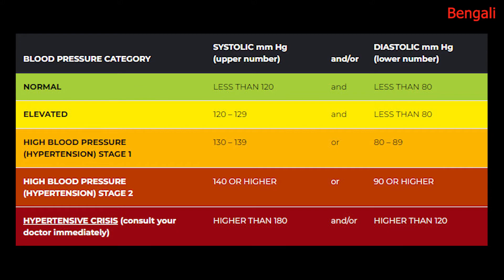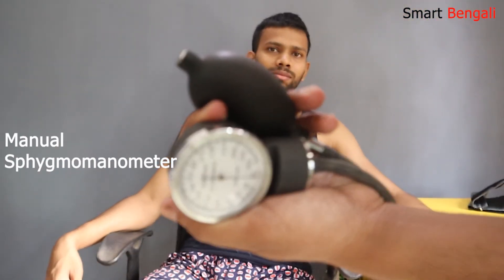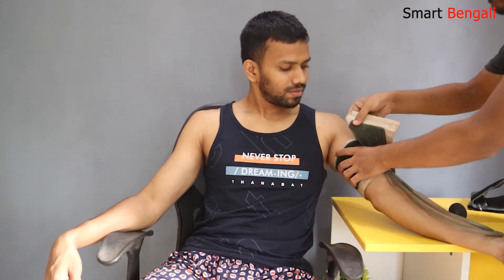Now I'll test the accuracy of this machine. I'm going to test his BP manually with a sphygmomanometer and compare it with our previous result. This is my trusted manual machine which I've been using for quite a long time. You should keep 15 to 20 minutes gap between measurements to get an accurate result.